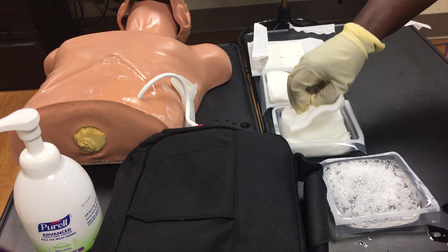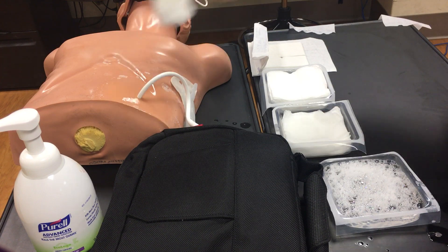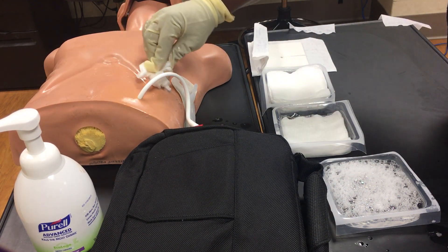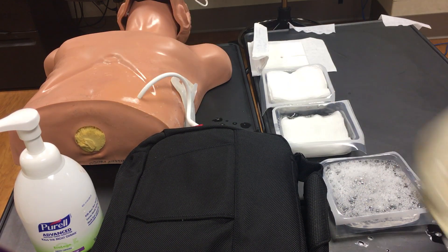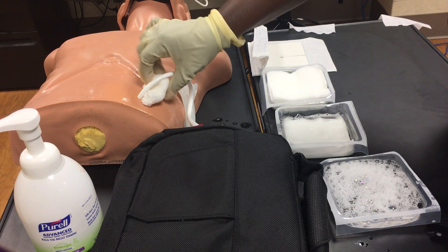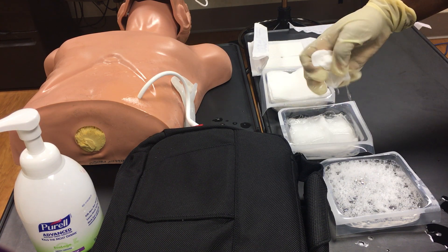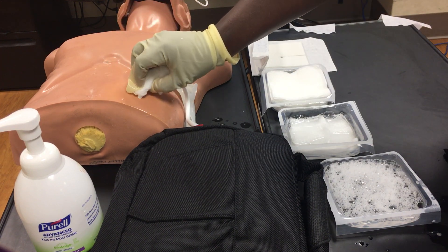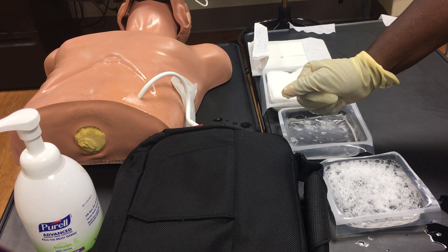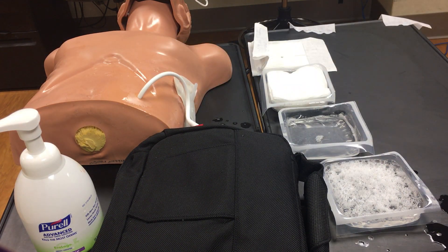Next, rinse the area. Take the saline-soaked gauze and rinse the soap off in a circular motion. Rinse again as needed. Use the last gauze in the saline pack to rinse any remaining soap residue on the driveline — gently glide it down to rinse. Be careful not to tug.